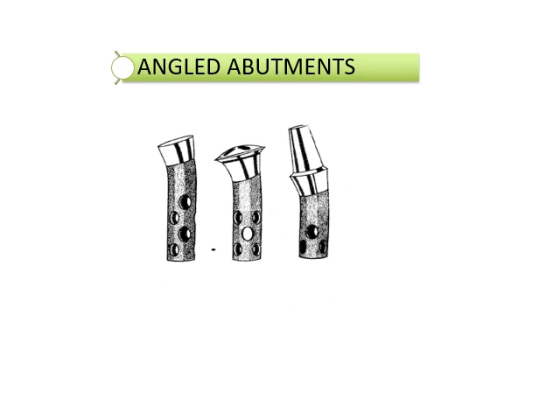This slide is just showing you that there are different sizes and shapes of fixtures and abutments depending upon the patient's needs and the location in the mouth, the angle that is needed for the crown to set in the dentition.